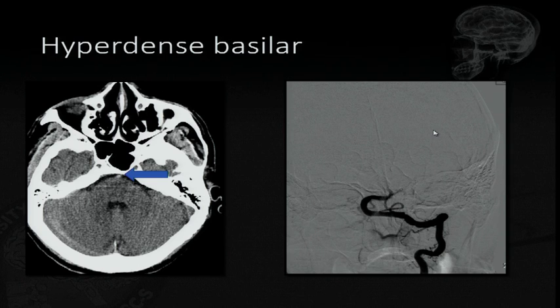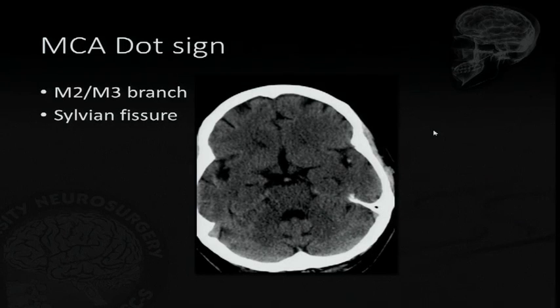When you and the neurologist converge in the control room, always ask them for the symptoms and focus on that side. And then you can go back to PACS and look at the whole thing, but you want to focus on the side of the symptoms when you're right there and trying to make a decision, especially when we go to the CT perfusion, because you'll be the ones that tell the tech if we're going to do it or we're not going to do it. I also put the symptoms in the history, because many times it just says stroke and you have to put them there. If you're sitting there and you know the symptoms, just put it there. It will help us when we do the final.